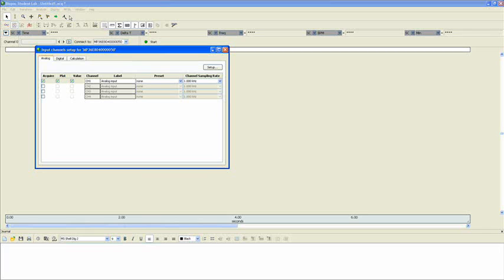For this tutorial, let's set up one channel of EMG, one channel of grip strength from a hand dynamometer, and also a calculation channel to give us our integrated EMG.